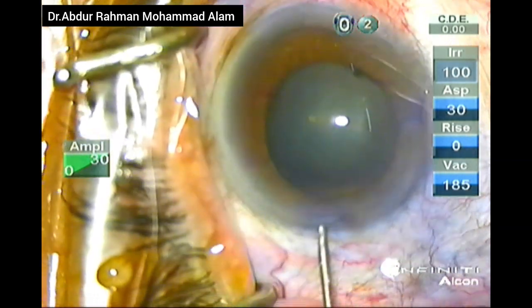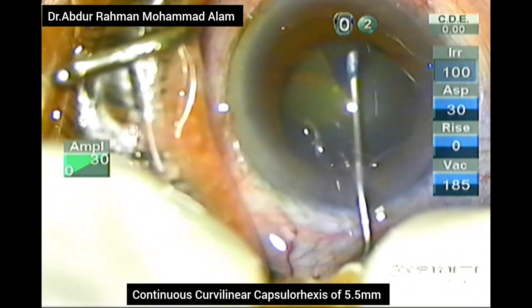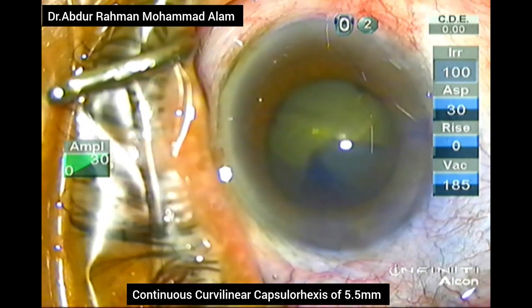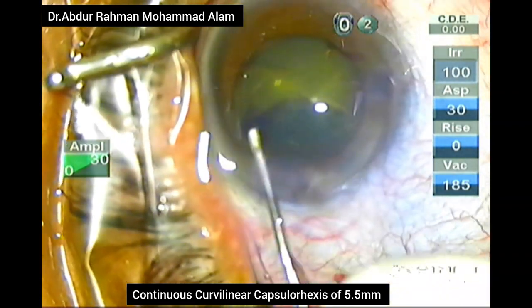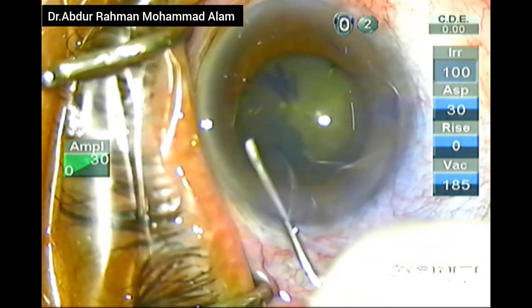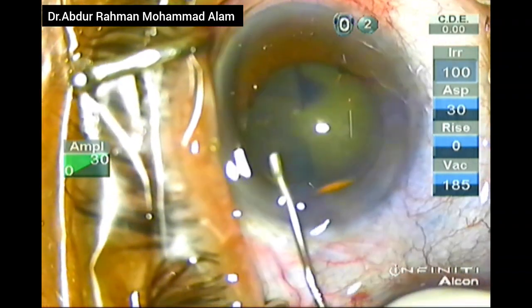OVD is again given to deepen the AC and cause viscomydriasis and flatten the anterior capsule. Now I will be constructing a continuous curvilinear capsulorhexis of about 5.5 mm with a bent cystotome. For a successful CCC, you must always fill the anterior chamber with OVD and pressurize it more than the intralenticular pressure. When OVD is present in the anterior chamber, it flattens the anterior capsule and there is less tendency of the anterior capsule margin from running out.